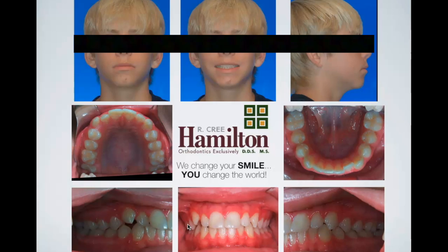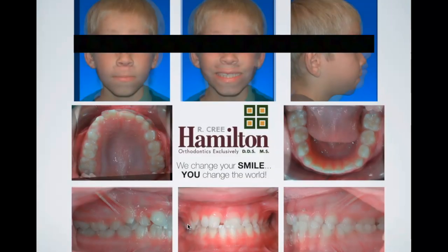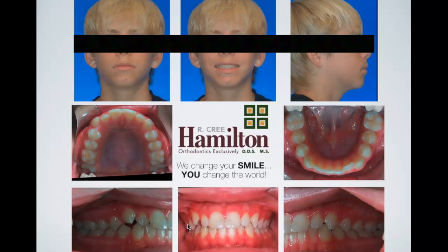So you mentioned the canine. Yeah, okay, so aesthetics. Okay, so there's crowding, right? All right, so let's say the crowding's gone. Anything else aesthetically? What goals do we have with this case aesthetically? And we talked about this a little bit when we saw his initial photos way back. All right? So what else do we still want to accomplish with this case? Yeah, we want to improve the incisal display, right?